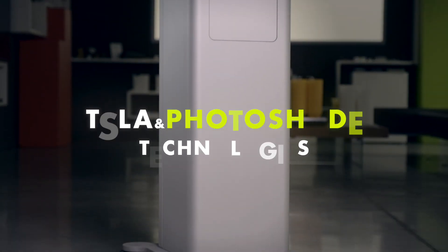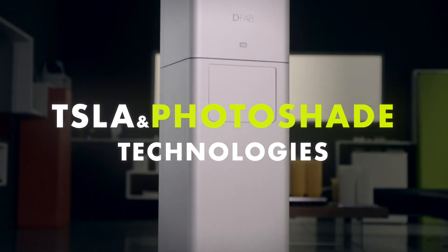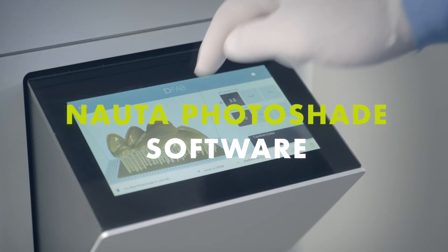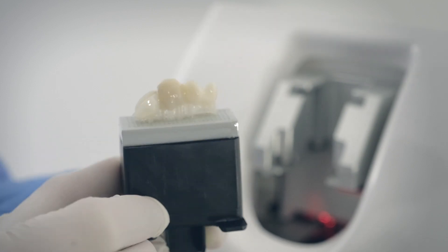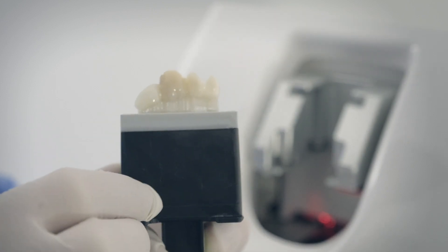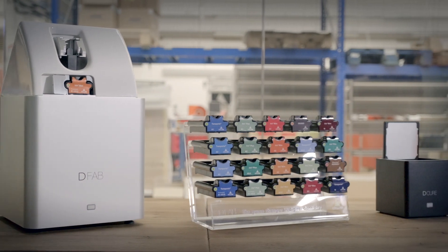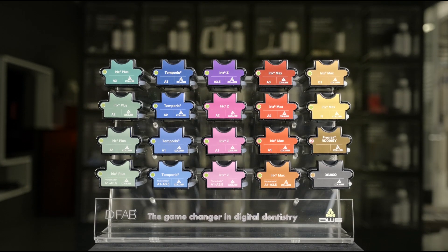The combined adoption of the revolutionary TSLA and Photoshade technologies, together with the Nauta Intuitive software, makes it possible to reproduce the natural tooth color gradient and use an exceptionally wide range of certified biocompatible materials available in disposable cartridges.